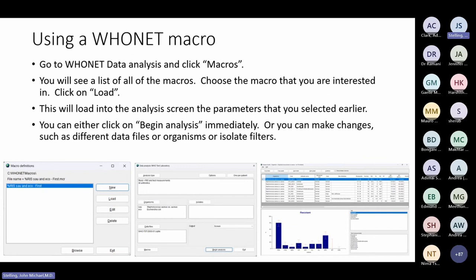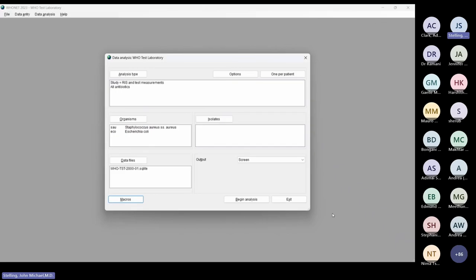How do I use the macro? Go back to data analysis, click Macros just like before, but instead of clicking New, click Load. Find the macro you want and click Load — this loads the macro into the analysis screen and you're ready to begin analysis. You can begin immediately or refine the analysis by changing data files or organisms. On the left is the screen where I created the macro; when I click Load, the macro details come back, including the 'one per patient — first isolate with antibiotic results' setting.